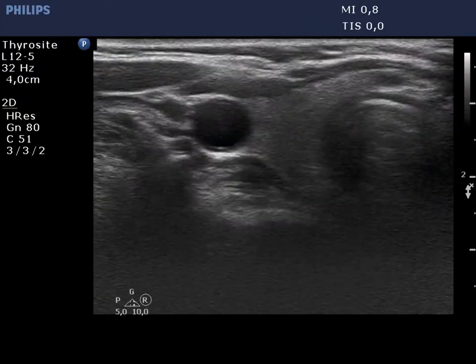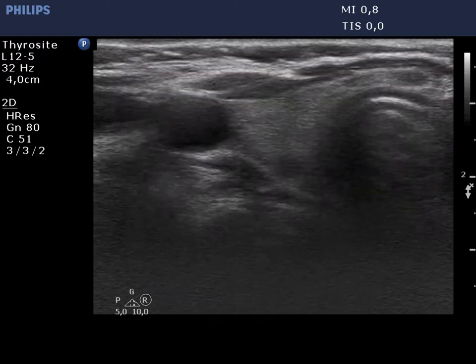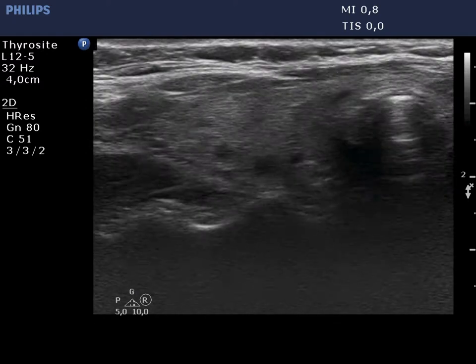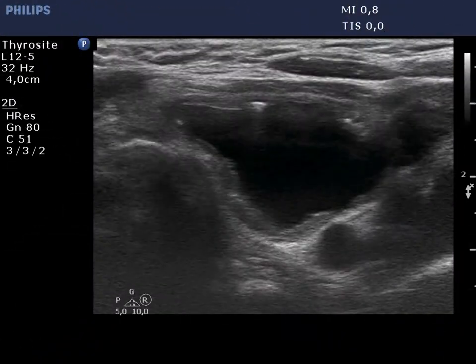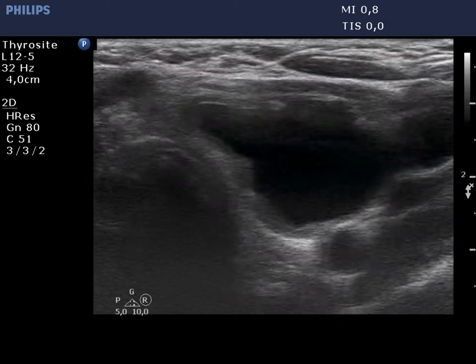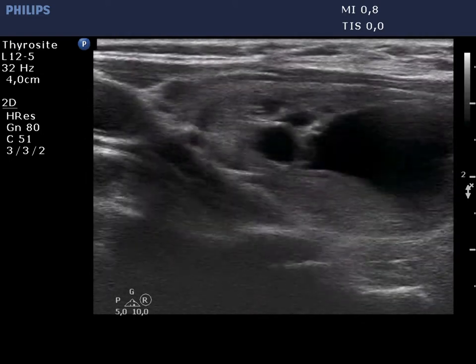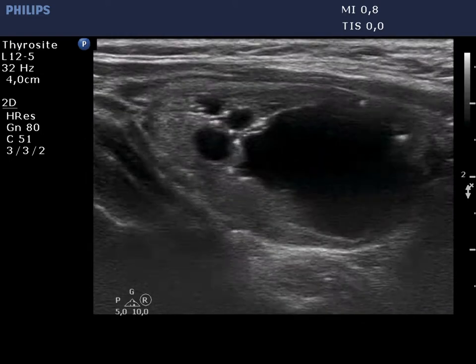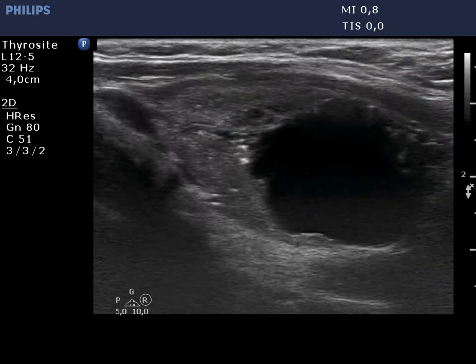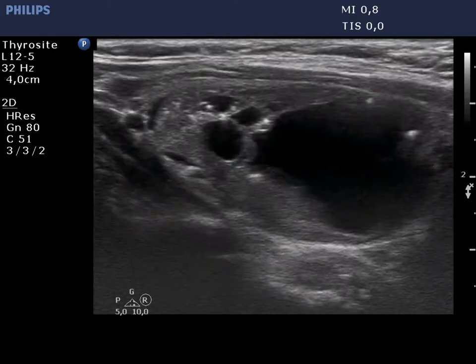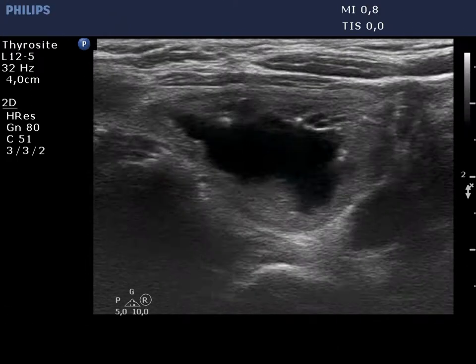The previously resected right lobe is echinormal and has several small, insignificant lesions. The left lobe has a cystic nodule which seems to be central type on horizontal while spongiform type on longitudinal scan. The echogenic figures belong to the subtype caused by back wall cystic enhancement.